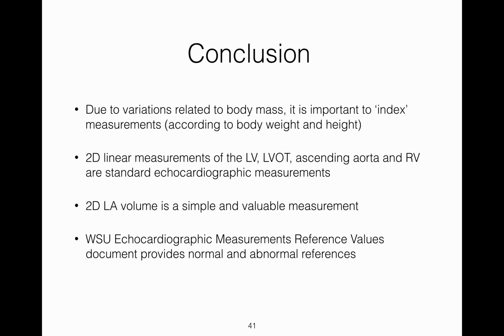The Western Sydney University Echocardiographic Measurements Reference Values document provides normal and abnormal reference values, which you should be familiar with.